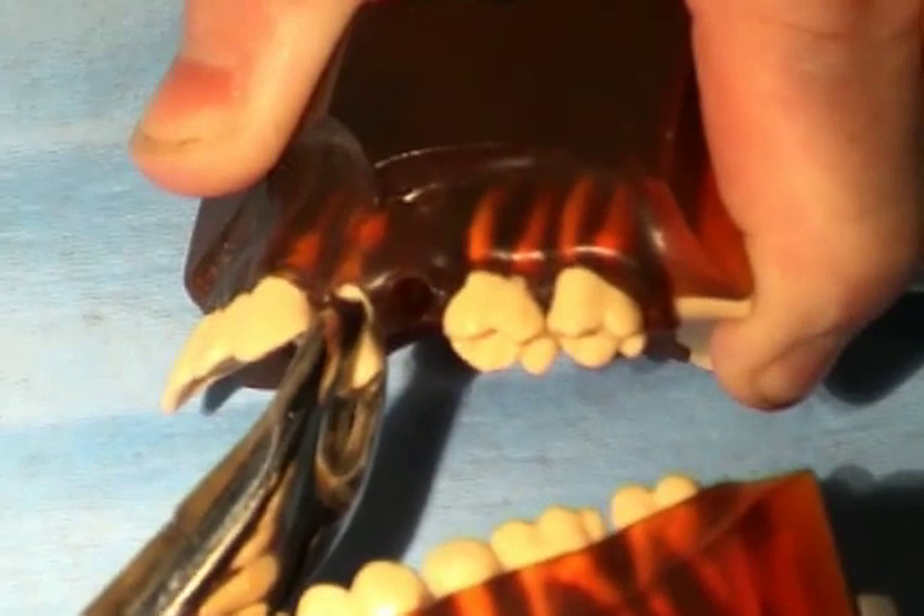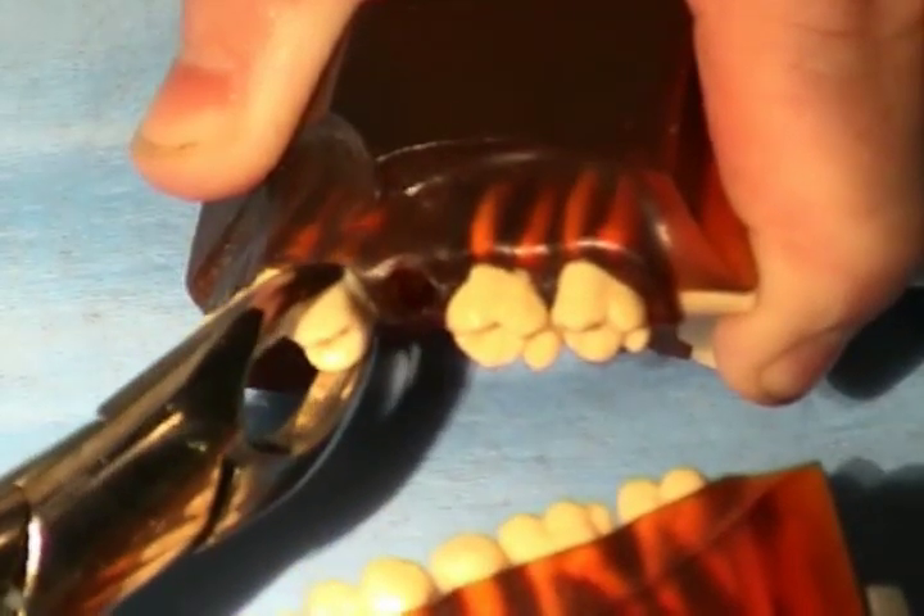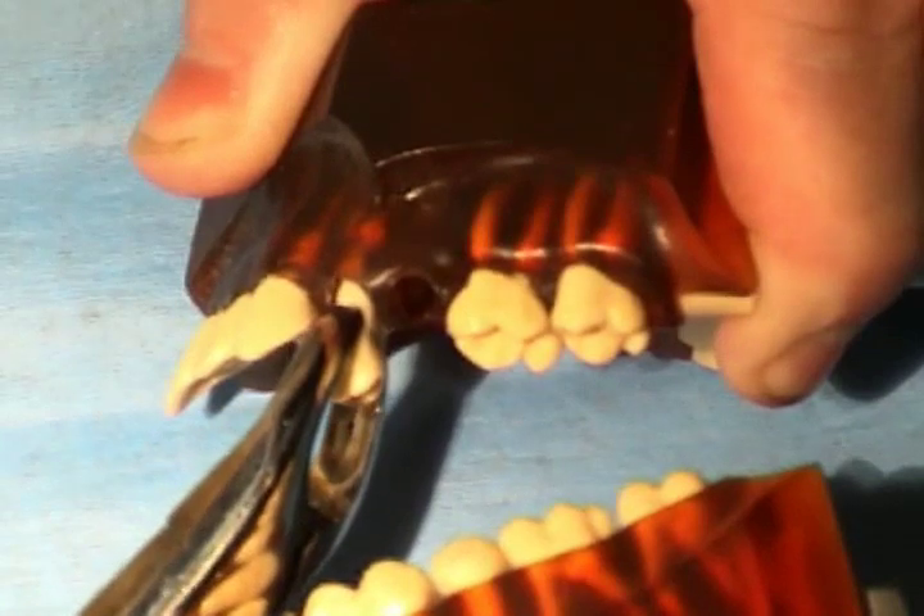When extracting a first upper molar, be careful with the pressure not to fracture the often very thin apices.